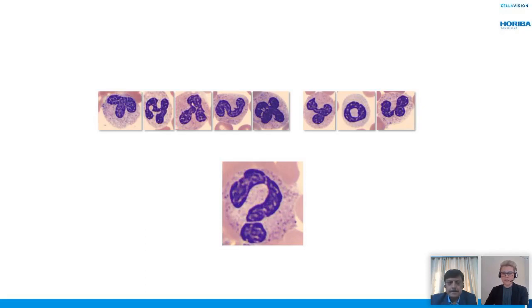With retained sample, you mean the blood tube itself? Yes. Here we have a limit that the blood smear needs to be made within 4 hours after it has been drawn, to be able to get the best out of the smear.